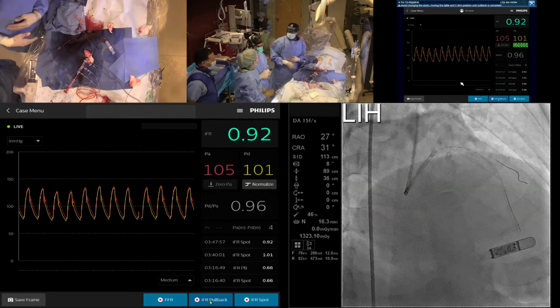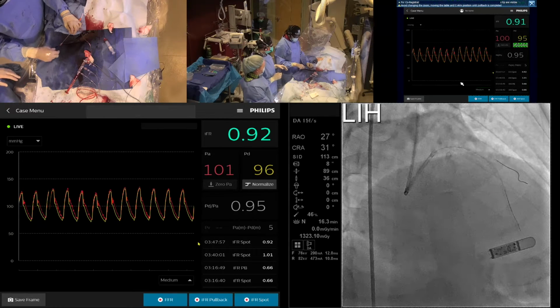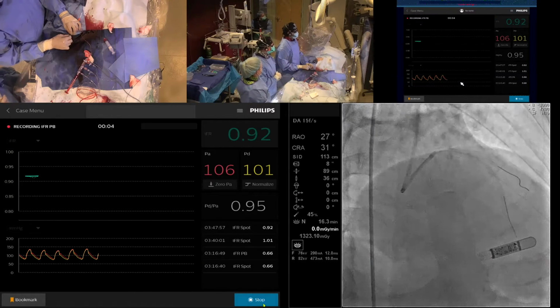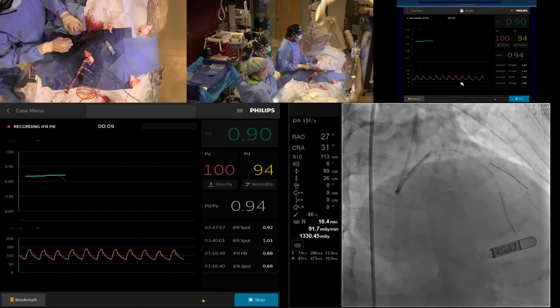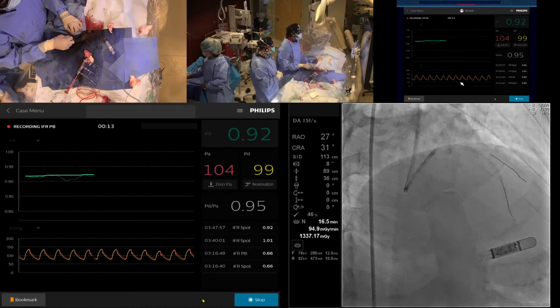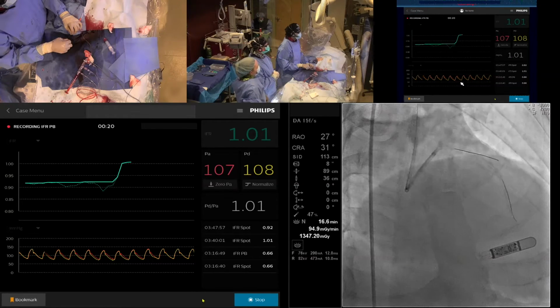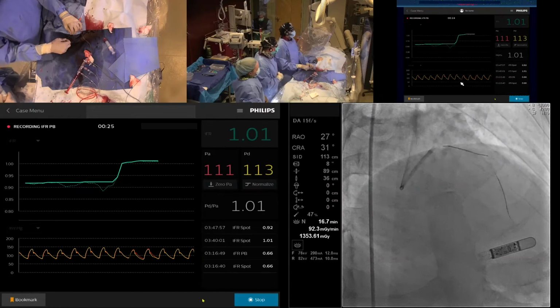Let's come on over and wire this for me, will you? So maybe let's do a pullback to this, right? Sure. Okay. That's perfect. All right, let's do it. Anytime you're ready. You just take the wire and you pull. It's very easy. Yeah, so there is a jump for sure. Good news is all of the pressure loss is in this one location.